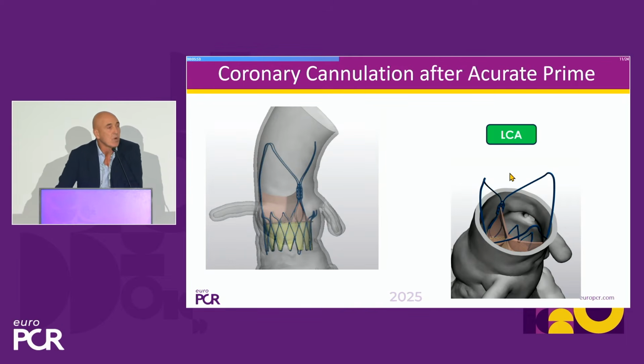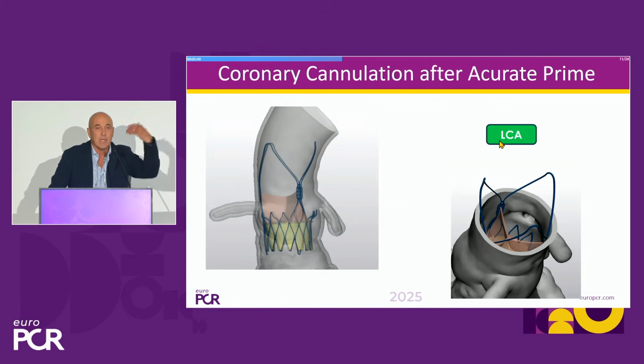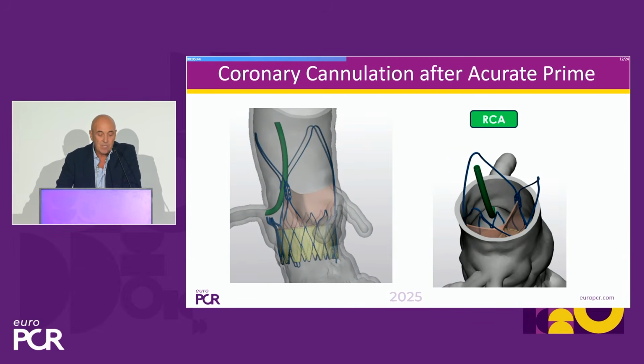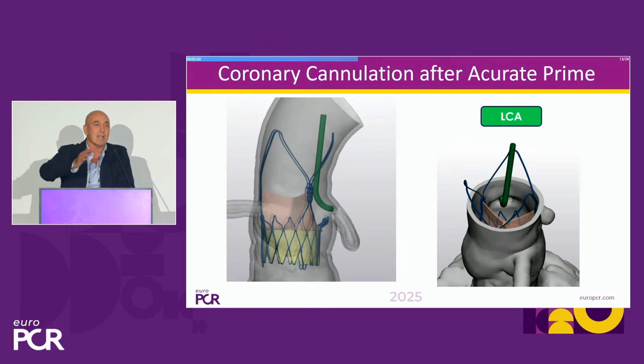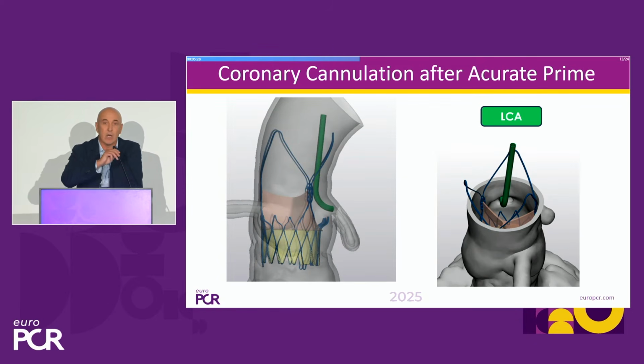So with this model, we can simulate the access of the coronary in case we need, on this lady, to perform a coronary angiography in a very easy way. Even using the radial approach, we are able, through the stabilized arch, to go inside the right and inside the left. It's not just a drawing; it's the real case we have just seen live in the box case.